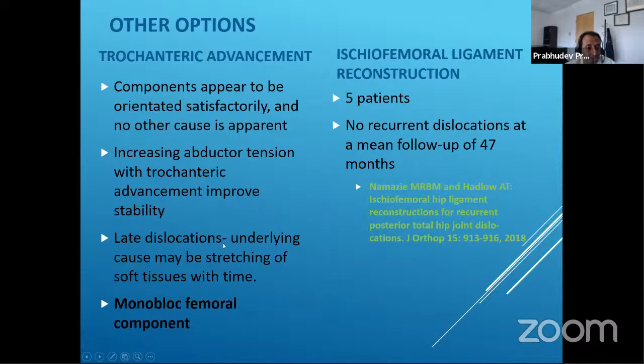Again, in some late dislocations, when the underlying cause may be stretching of the soft tissues with time, and also particularly in case of monoblock femoral components. With more modular type of femoral components, we have so many different options to improve the soft tissue tension.